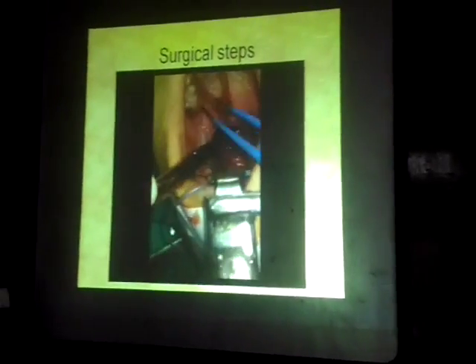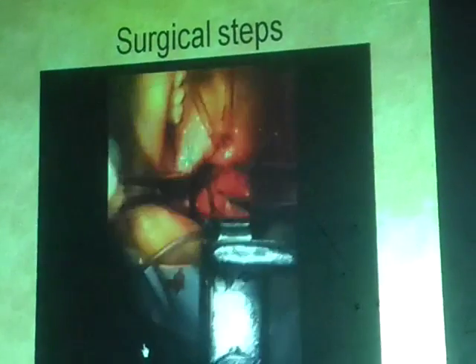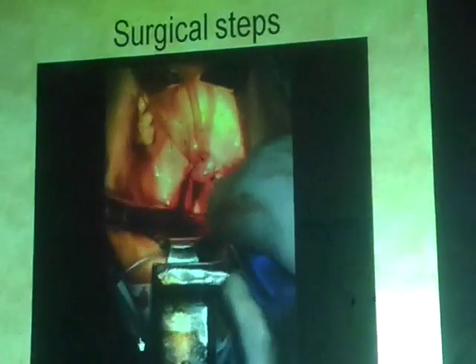So by standing face to face to the patient, you will have access to the adenoid bed, and you can see it, and you will almost be sure that you are not leaving remnants and you are not leaving a spurter or a bleeder behind.